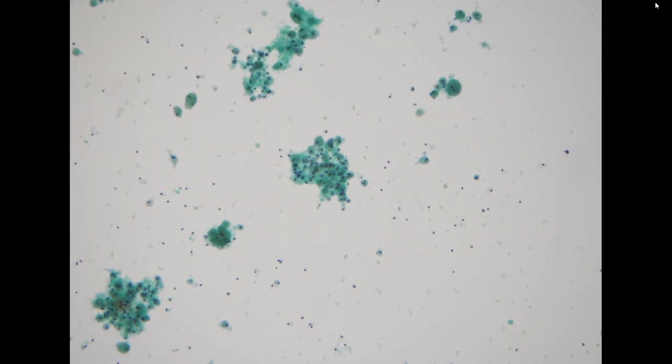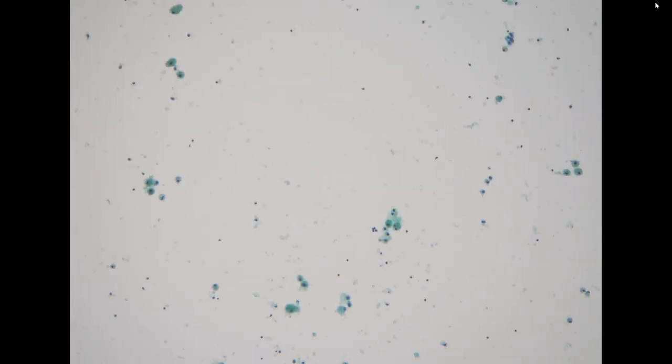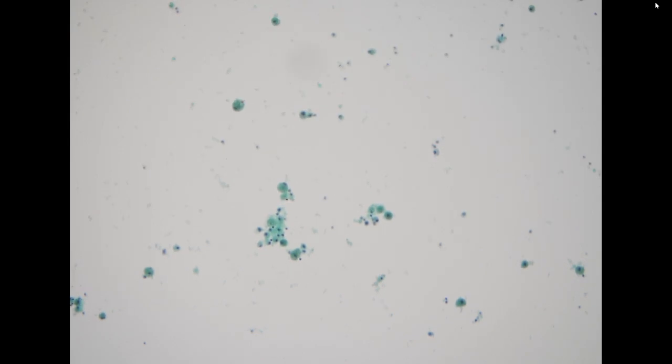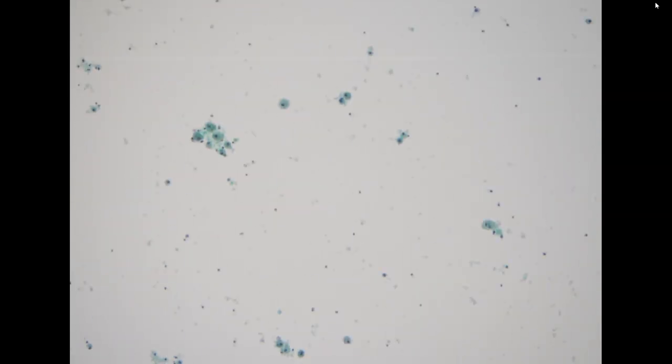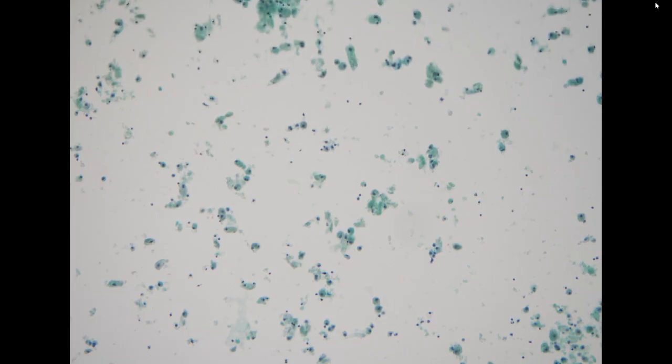In this type of specimen, usually we want to check if there is any epithelial element for the diagnosis. Without any epithelial element in this type of specimen, cystic fluid only, we will usually diagnose as non-diagnostic, category 1. But if the cystic component has some mucin, then we will diagnose it as AUS, category 3. This one, we didn't see any mucin, so we just need to screen the entire specimen to see if there is any epithelial component.